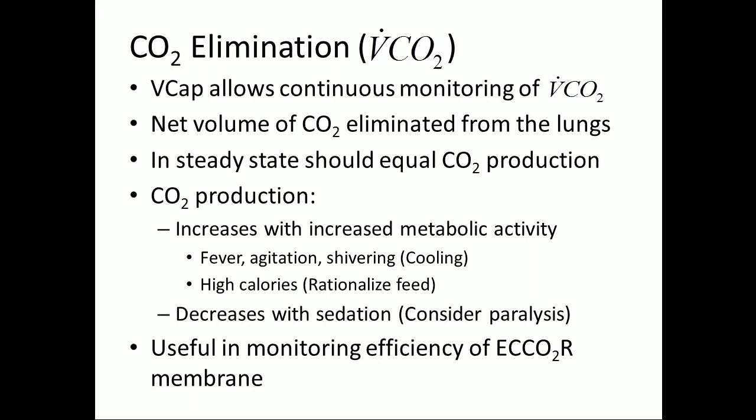And so it can be used as a marker of metabolism, particularly once you've reached steady state. The rate of CO2 elimination equals the CO2 production. And we know CO2 production goes up with certain conditions such as fever, agitation, shivering. High-calorie diet has also been implicated with giving you a higher VCO2.